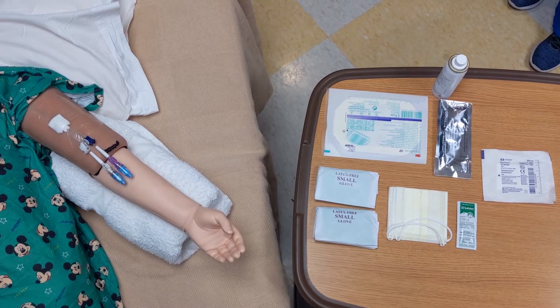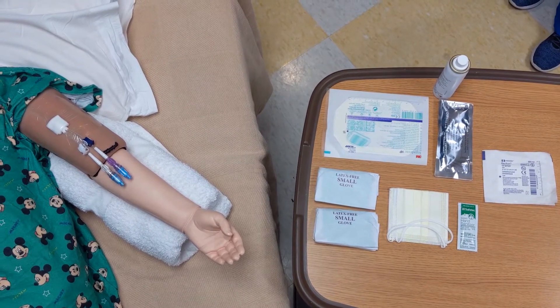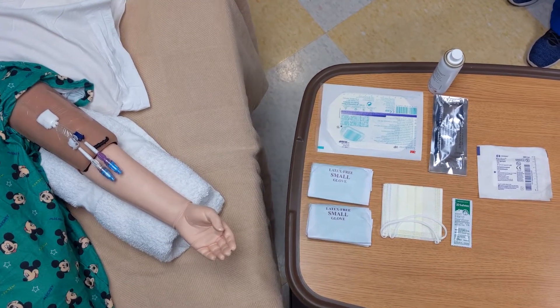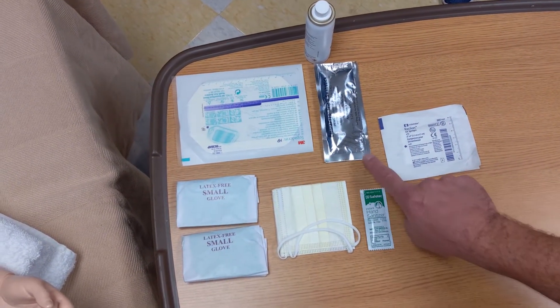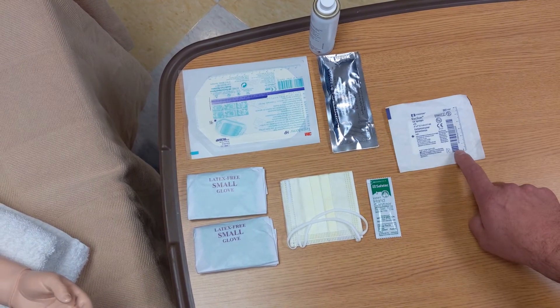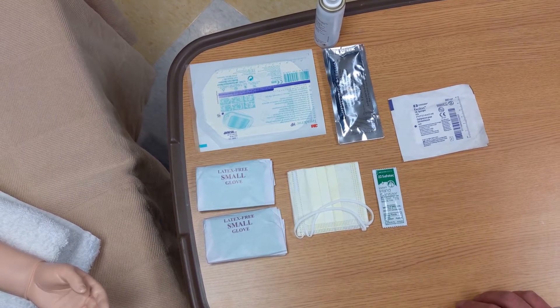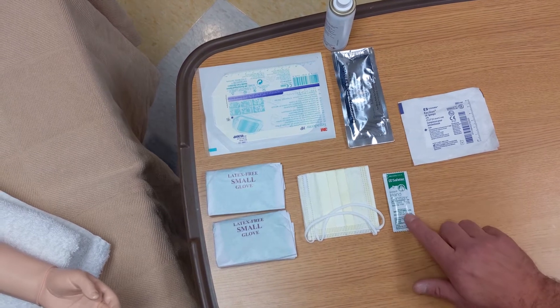This is the Global Hope CVC dressing change video. The first thing you want to do when you're going to change the dressing on a central line is gather your supplies. You'll want a clear adhesive dressing, CHG swabs, sterile gauze, enough masks for anyone who will be within three feet of the patient and the patient themselves, and two pairs of sterile gloves. You'll also want to have hand sanitizer nearby for hand hygiene.